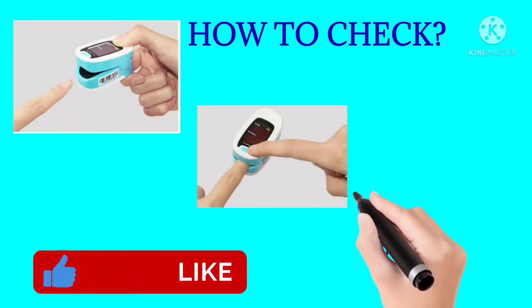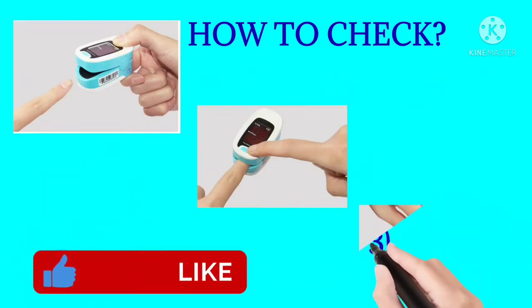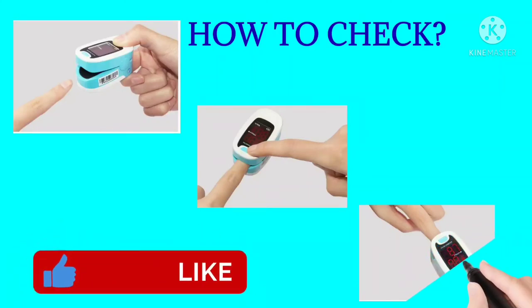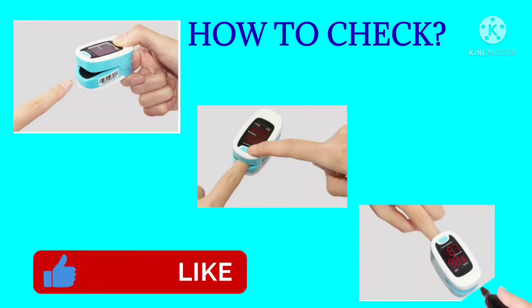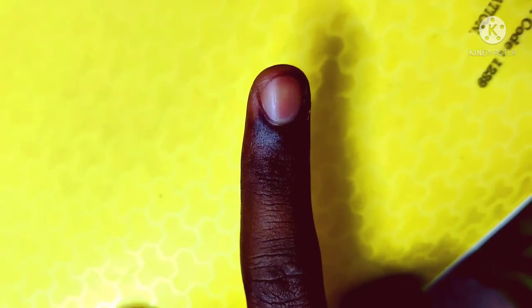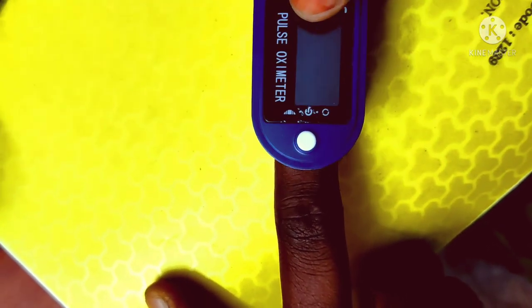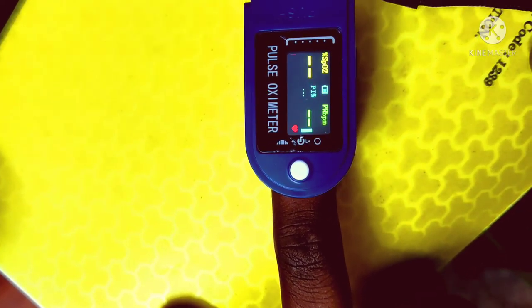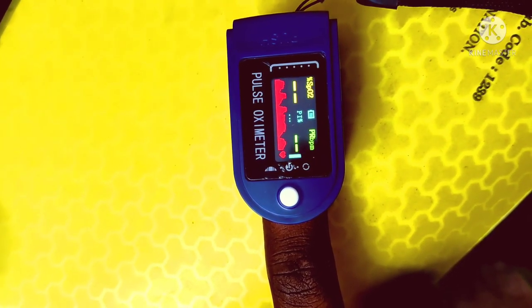Third step: press the button and insert the finger in the right direction. When you press the button the device will give you a reading. The display will show the SPO2 value and the pulse rate.